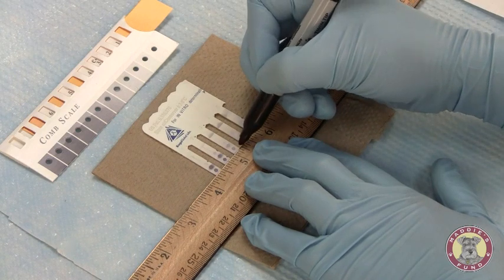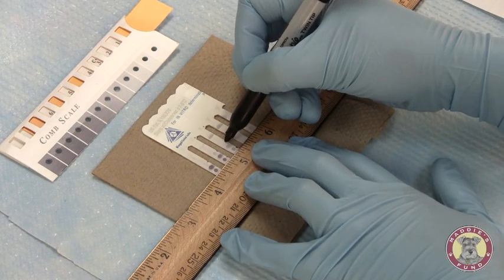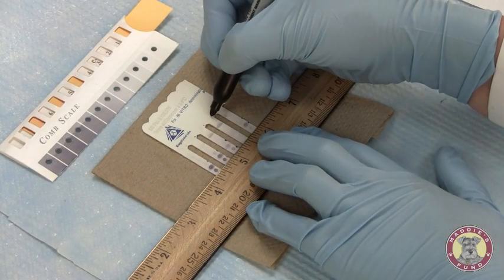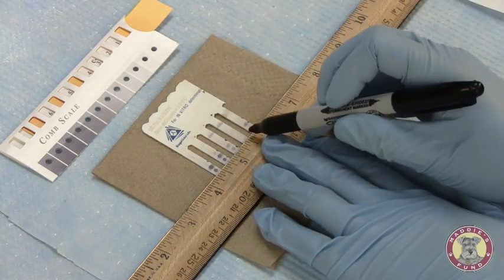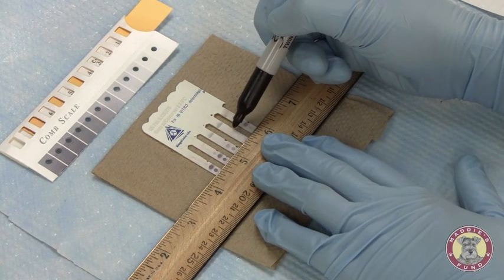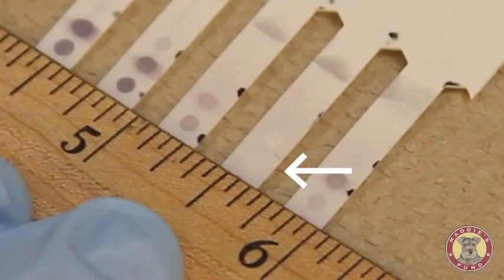Sample 3, parvo antibody — it's darker than the positive control, but not quite as dark as what we've previously seen. We will call this a 5. Sample 4, you can see we do have a slight bit of background occurring on our tooth, but not enough that we are unable to read the samples. There's a white circle present with no color development, so we have no parvo antibody present. We will call that a 0 or a negative.